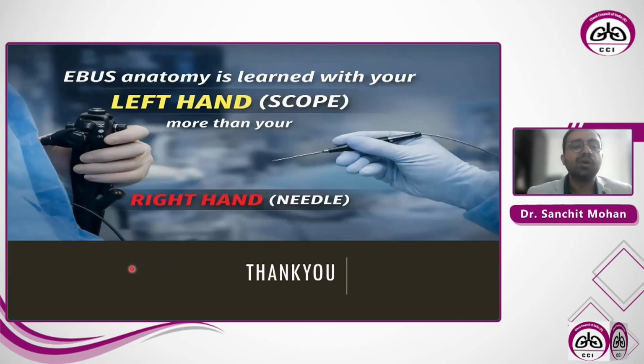So before ending my talk, I'll be ending it with a statement that EBUS anatomy is learned with your left hand more than your right hand. So you have to master your left hand first, so as to avoid complications from your right hand.